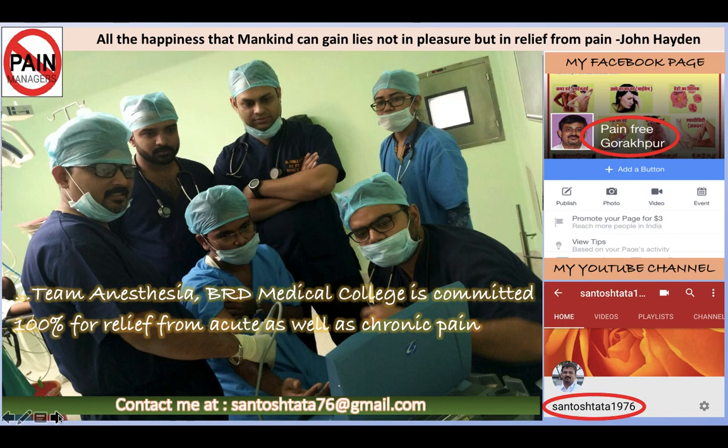This completes the first part of the presentation, and in the next part we'll be dealing with the other structures, which is basically the supraspinatus, the infraspinatus, teres minor, the posterior glenohumeral joint, and the acromioclavicular joint.